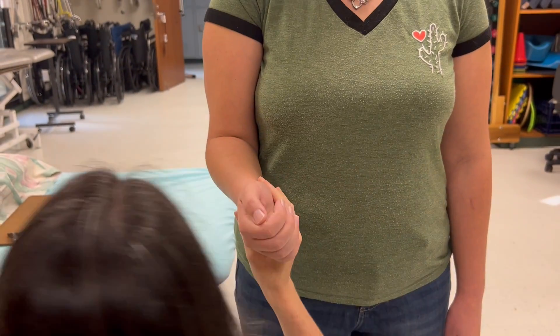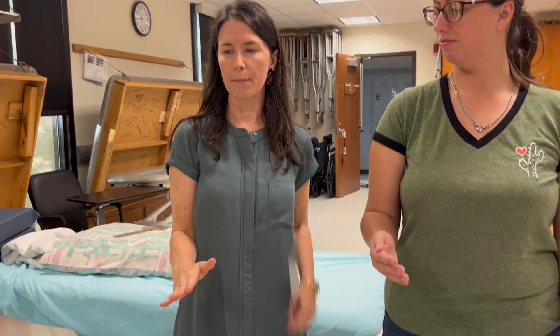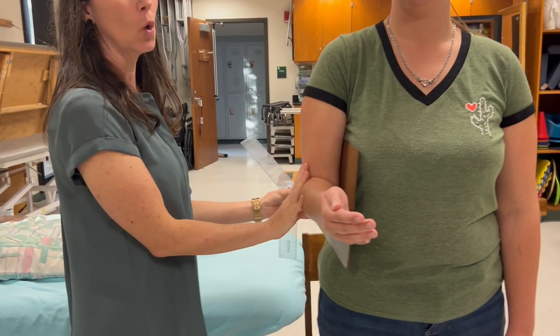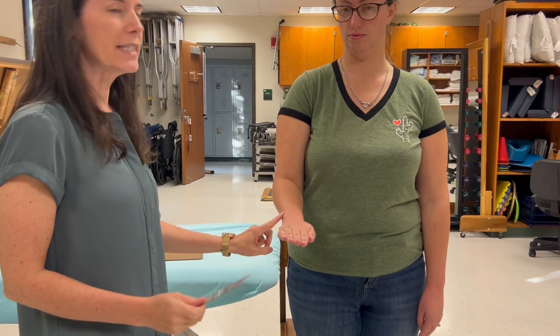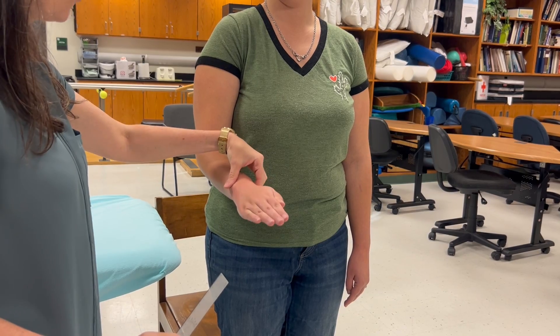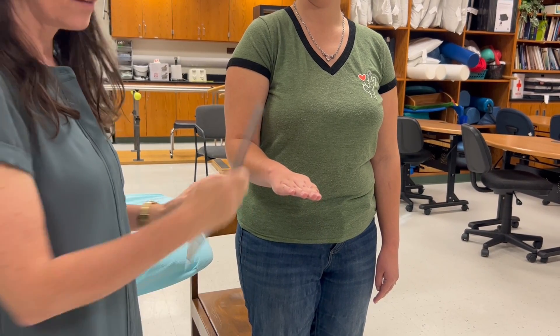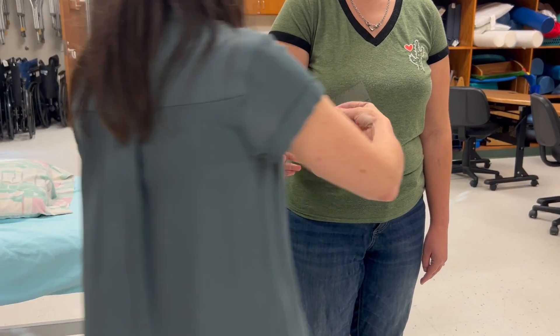For pronation, if someone is missing pronation, a few compensations: they might abduct their shoulder and internally rotate their shoulder. One cue we can give is to keep the clipboard in by their side and don't let it fall to the floor, because that makes it very hard for them to compensate with shoulder motion. Turn palm down. The fulcrum still goes just proximal to the ulnar styloid process. A common student error is not realizing that with supination the ulnar styloid process is on one side, and with pronation it's on the other side — so where your fulcrum is placed will switch, but it's always at the ulnar styloid process, proximal to it.